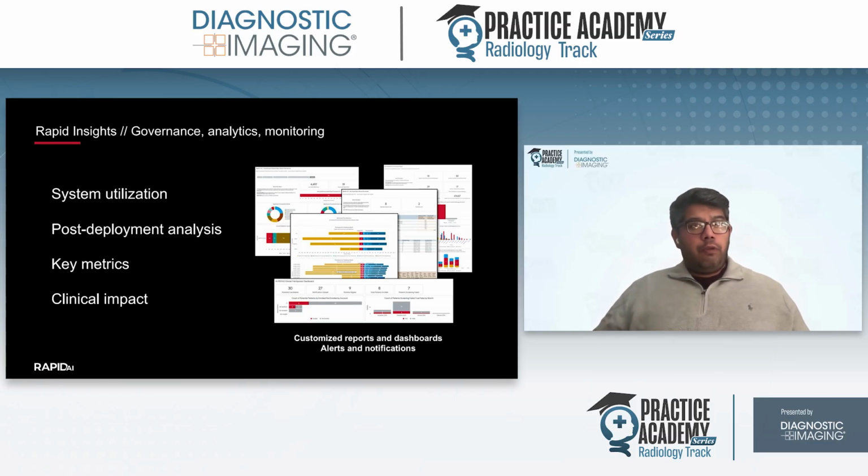But what else this is really good for is being able to see the different kinds of metrics, like when do we have a surge in the number of studies that are being ordered. That can then help us decide how we want to staff. Do we need more staff at a certain site? Do we need more radiologists? So all of that becomes extremely helpful from an administrative standpoint to really be able to handle the increasing volumes, as something that you alluded to that's becoming increasingly more challenging.